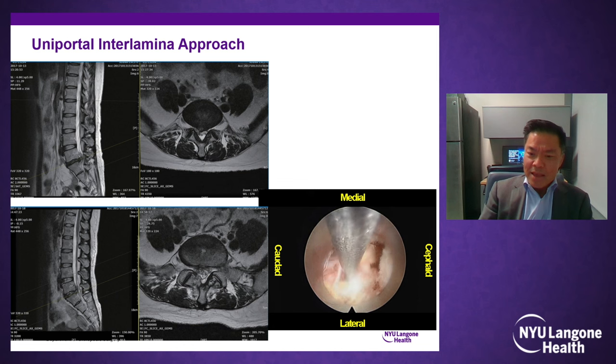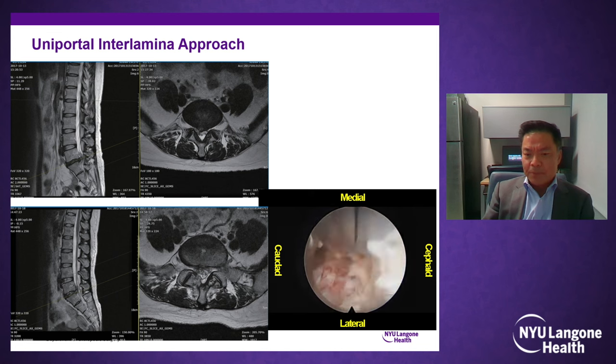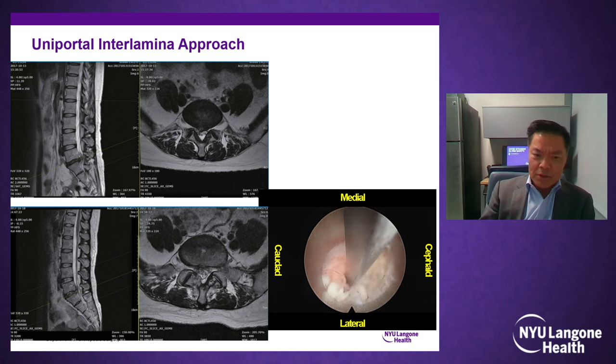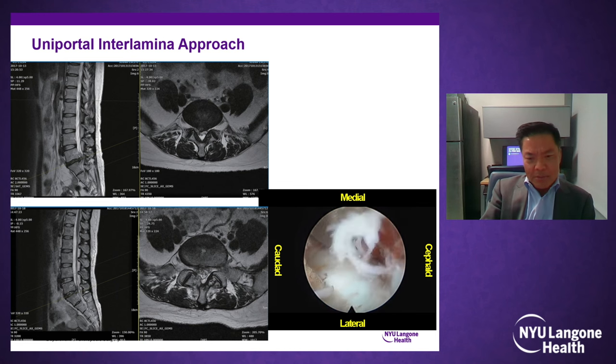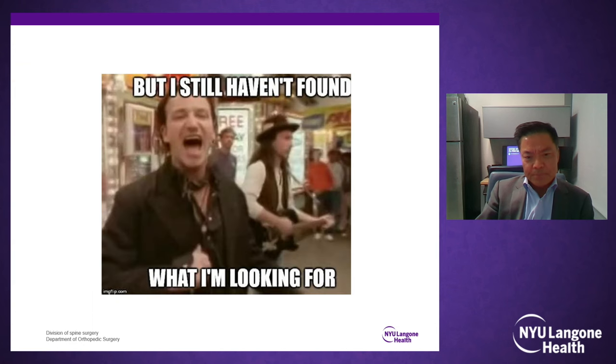But again, although you could visualize the area of pathology, the whole field of view is very limited. That leads to frustration, difficulties, a very steep learning curve. So although I went to Korea a couple of times to really try to learn this technique, every time I came back, I could not make that jump. Because I still haven't found what I was looking for.